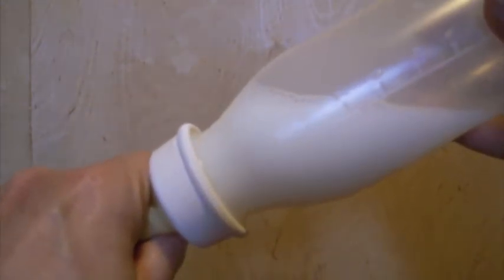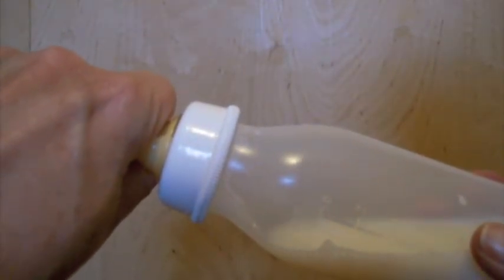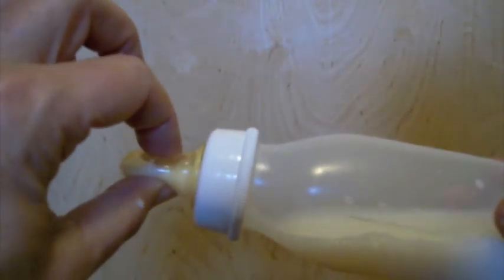If you know about the pacing technique — where the baby has the bottle in their mouth and they're sucking but then become overwhelmed — it does no good to pace by tilting this nipple out, because any compression will still get milk out of the nipple. So if the baby is being overwhelmed by the flow, you actually have to take the nipple out of the baby's mouth.